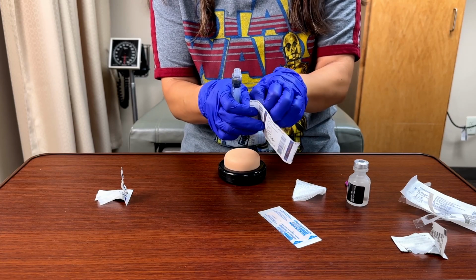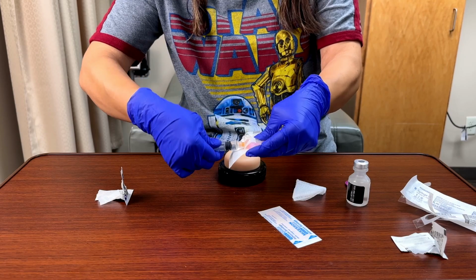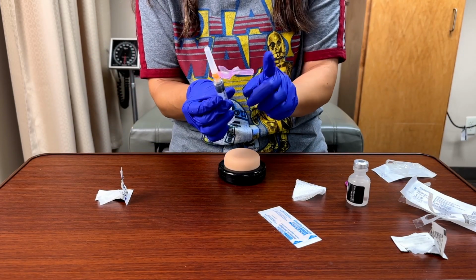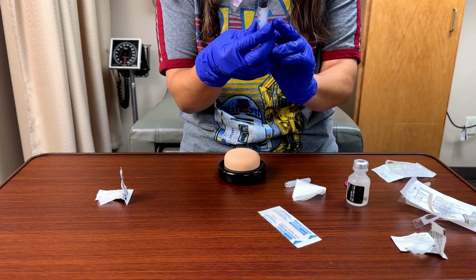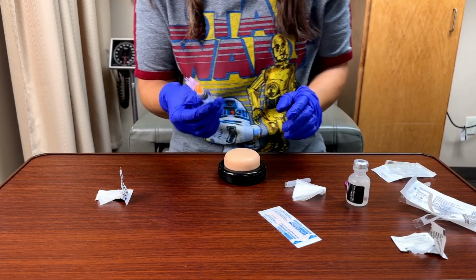So I'm going to open that up, and I'm going to stick it on there. Gentle push, turn, take this off. This is a guard so that it locks after you're done. So I'm going to open it up. I'm going to make sure that this one is nice and prepped. So I'm just going to push until the liquid gently comes out of the top there. Now I'm ready to do my injection.